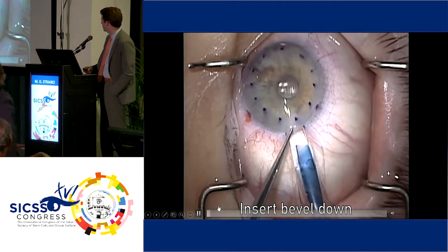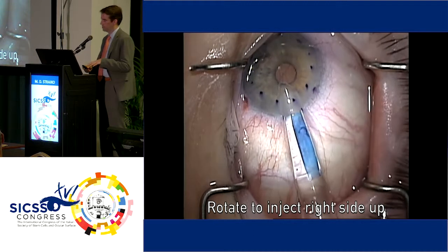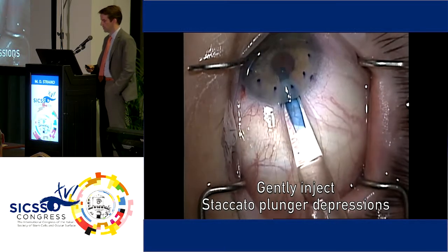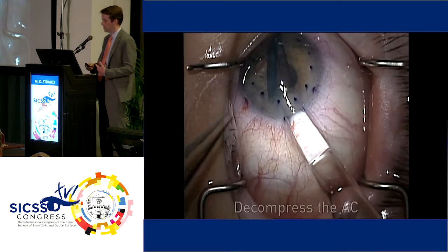So I always insert the injector bevel down into the anterior chamber and then rotate it. After it's inserted, then I rotate to get that V on top and inject. Inserting bevel down helps maintain the anterior chamber better. So gently inject, very staccato plunger depressions. You don't want to overinflate the anterior chamber because then the graft will come flying back out.